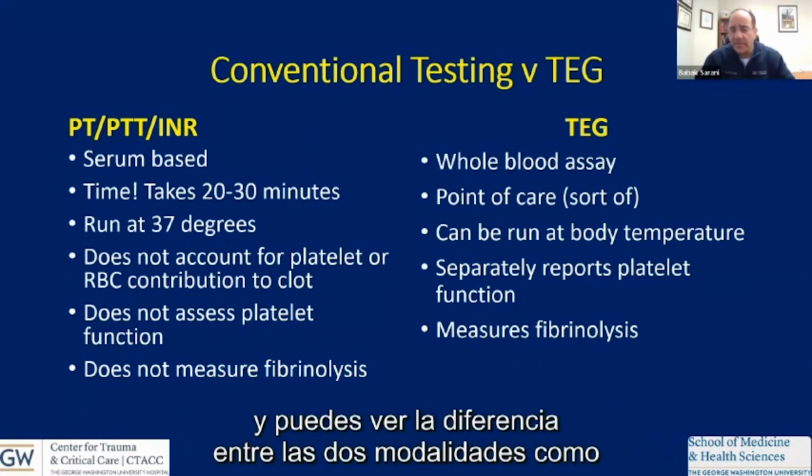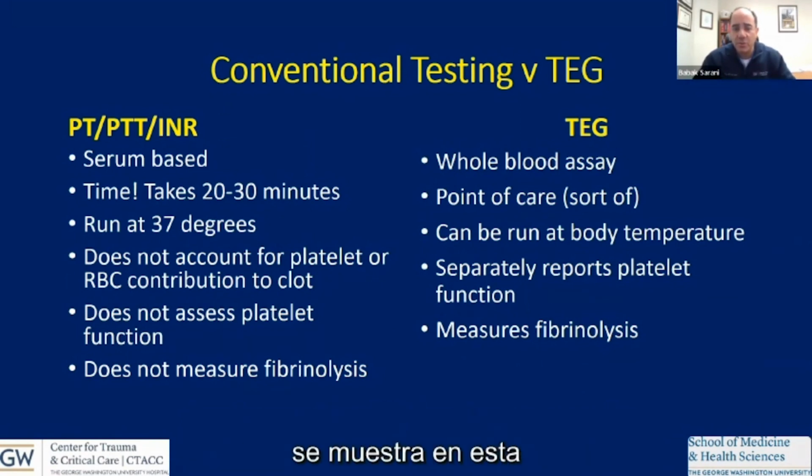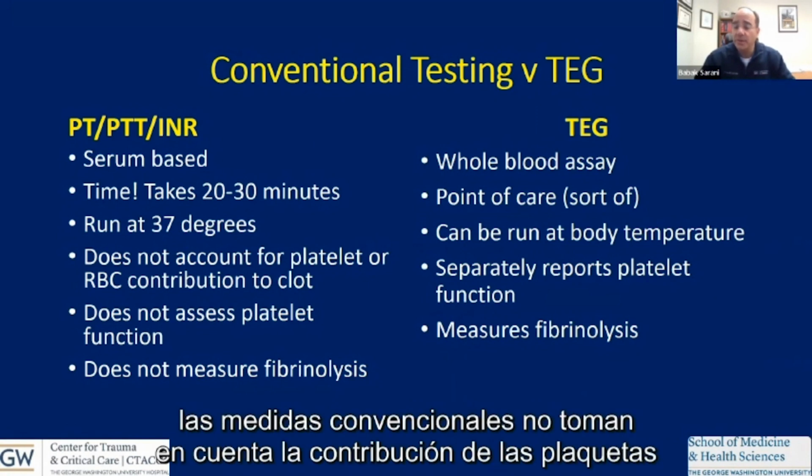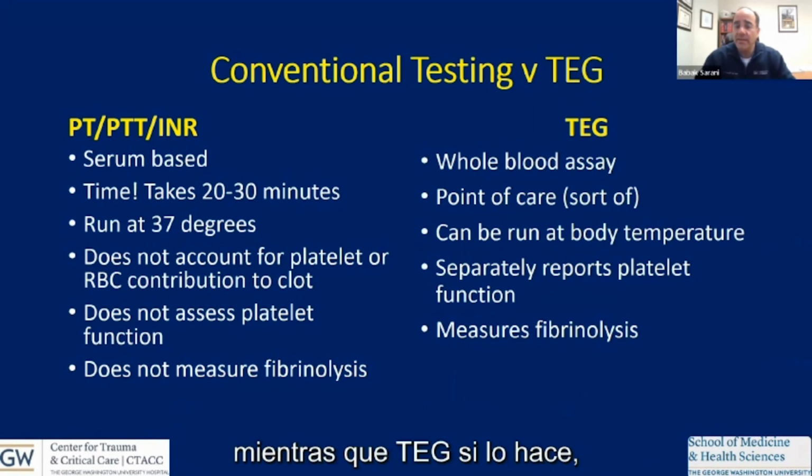And you can see the differences between the 2 modalities otherwise as shown on this slide. And we already talked about how conventional measures do not account for the contribution of the platelet, whereas TEG does.